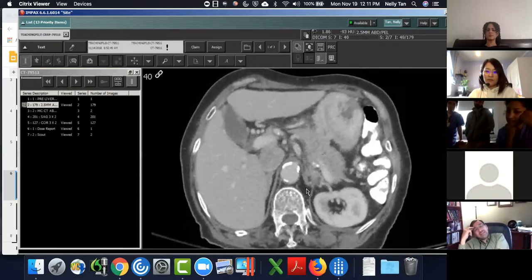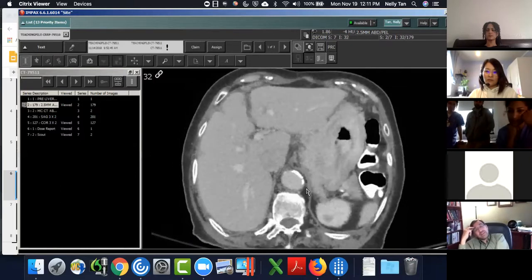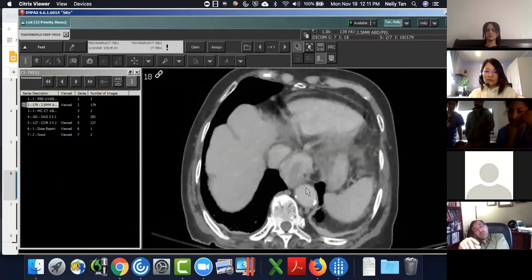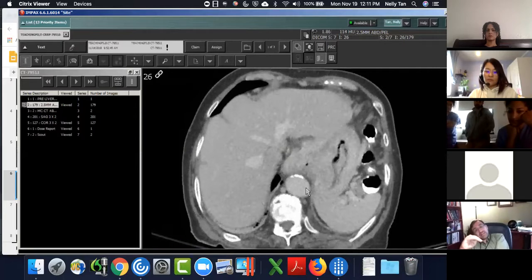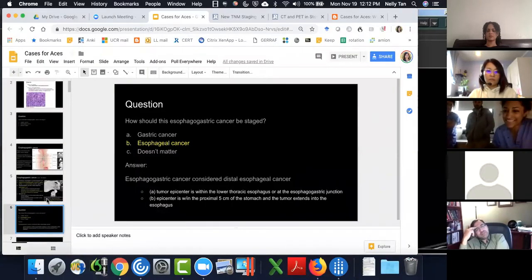It reminds me of a case where I saw a stomach that I thought, and the surgeon thought, was linitis, and the whole thing was like twice the thickness of this, but it didn't have that layered, striated appearance, so it wasn't light on the inside, then dark on the outside. It was kind of all dark, and it was actually just gastritis. I don't have that case to show you today. I didn't have cases prepared today because we're short-staffed and I've just been doing a million things. But it reminds me of that case, that's for sure.